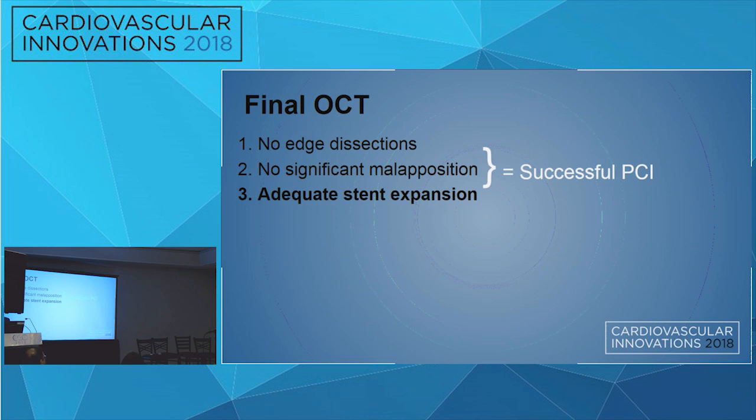Very good. Any comments? No, it's a great case. Good use of technology to simplify it. It's too bad the CT can't tell you whether it's circumferential or not. It would also be very nice, but the blooming artifacts tend to make it a little inferior in that regard.